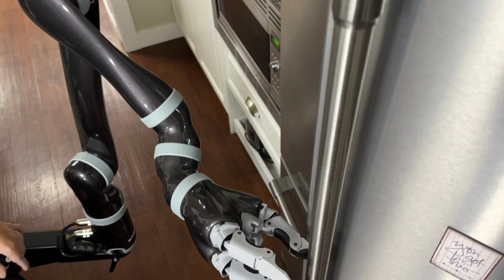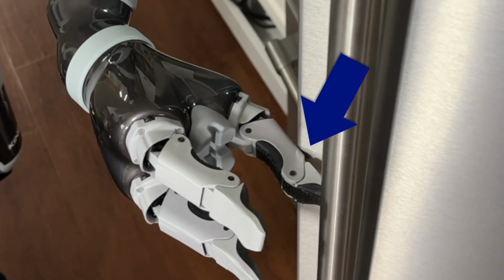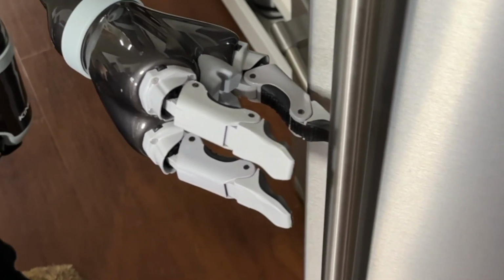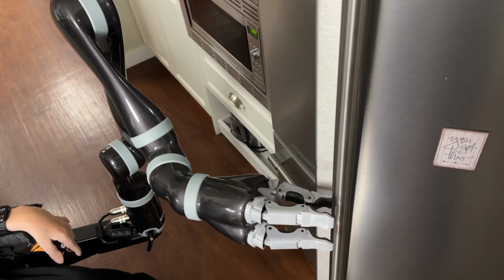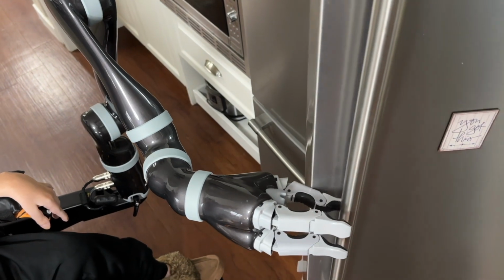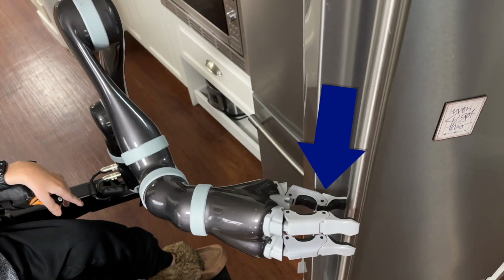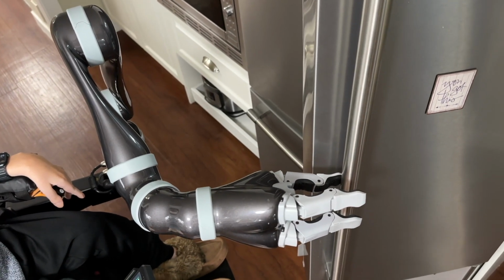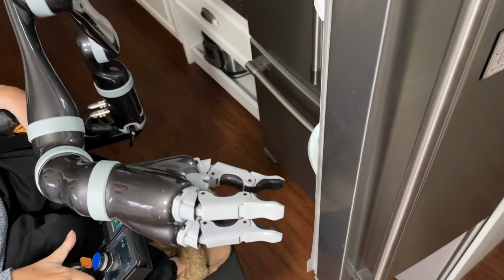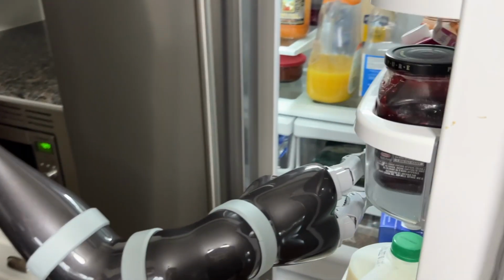We've opened it a little bit, and as you can see right here, we've reached a point where Jaco's finger is at risk of being bent at a bad angle. So I'm going to use B3 to rotate the hand just a little bit so that we can continue to push this door open. So we're going to keep pushing, and then again, we're going to rotate the hand just a little bit and continue on our journey. We've now got the door open far enough, for my fridge at least, and now we're going to get our hand inside and push it open the rest of the way.